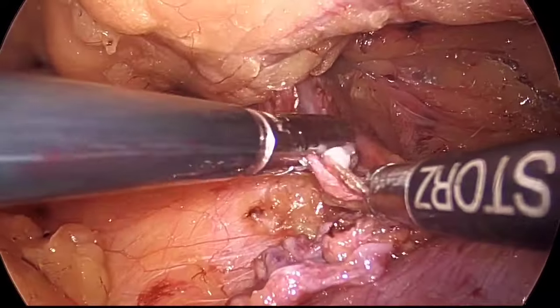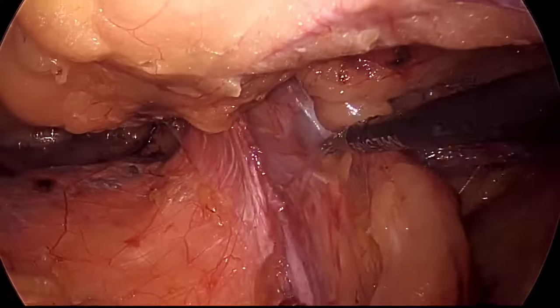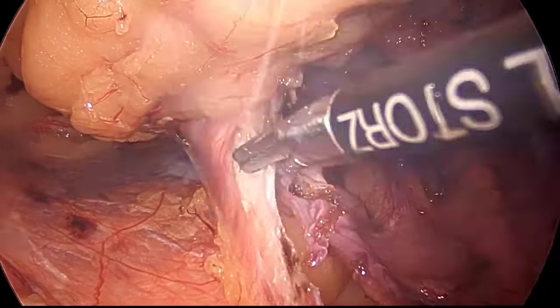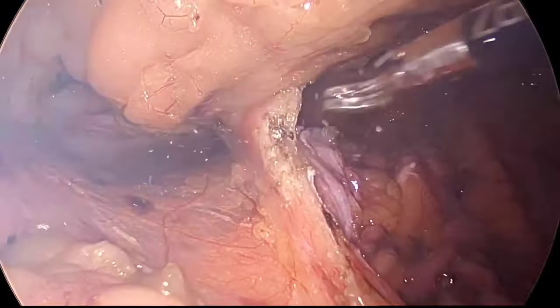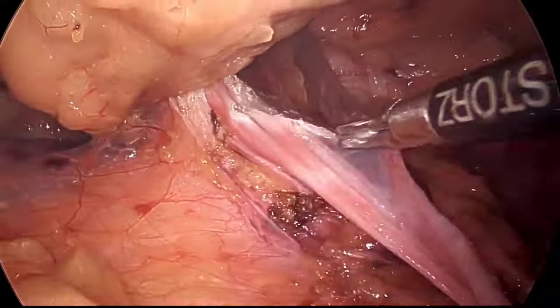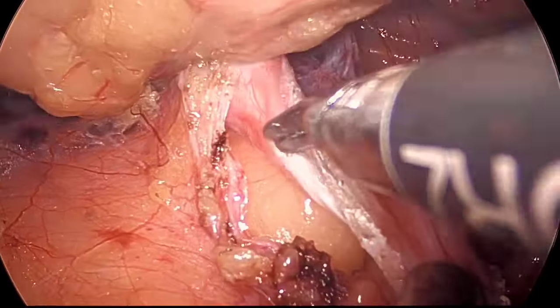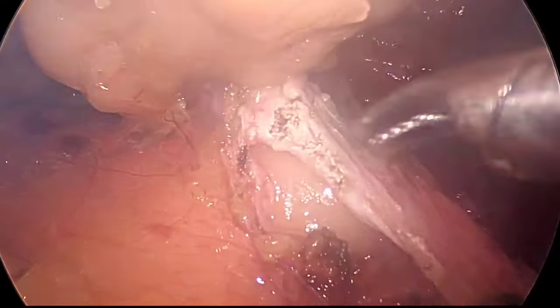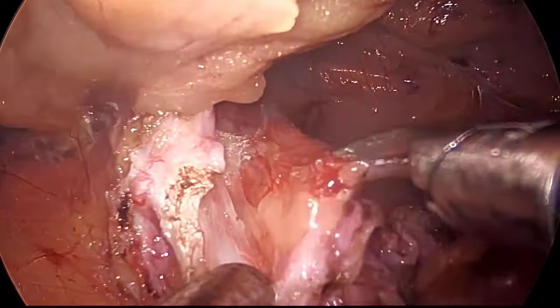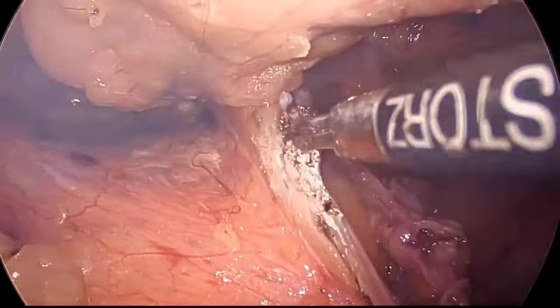So here in the front aspect of the sac, there is no vital structure, but when we will be going towards the back of the sac, there will be cord structures, the vas deferens and gonadal vessels, which we should take care of. And while dividing on the upper aspect, the inferior epigastric vessel should not be injured. So you can see very gently I am just trying to dissect and identify the margin, and then gradually using a little bit of cautery at a time, dividing the sac all around, so almost reaching up to the circumferential division of the sac.